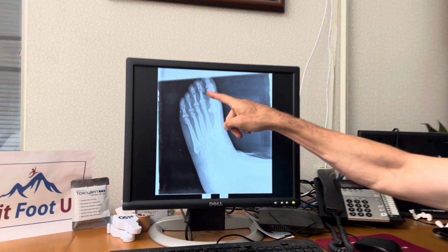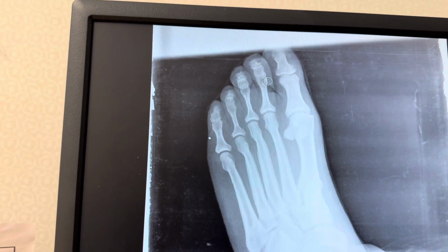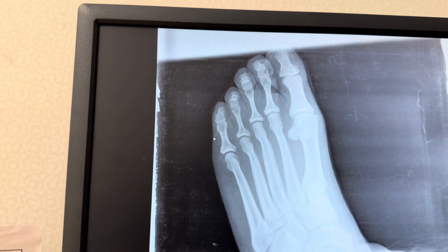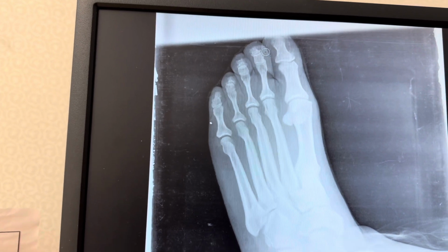We're going to pan up right close to the second toe here. This is where the mucoid cyst is, and in this case, we can drain it and that's fine. But as soon as there is pressure right there, it'll form again. But we're going to take care of this problem right now.